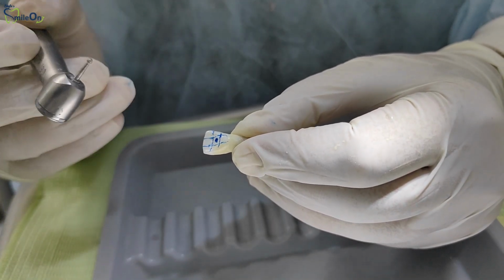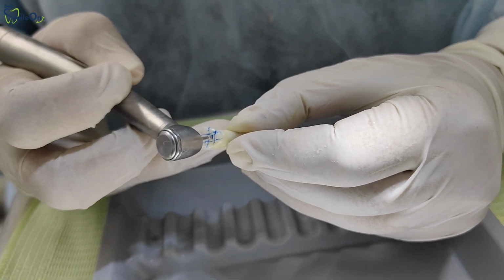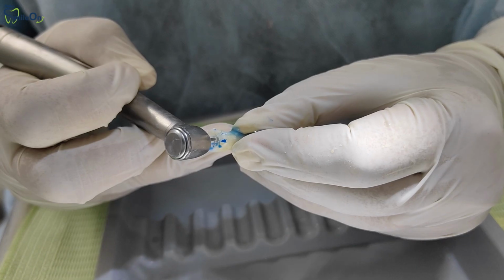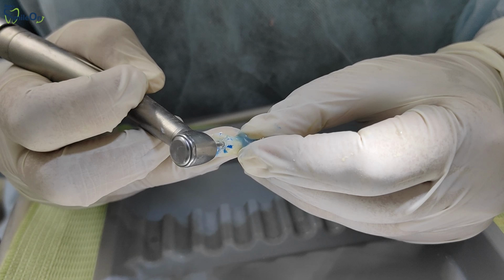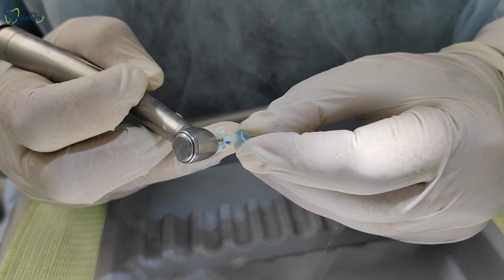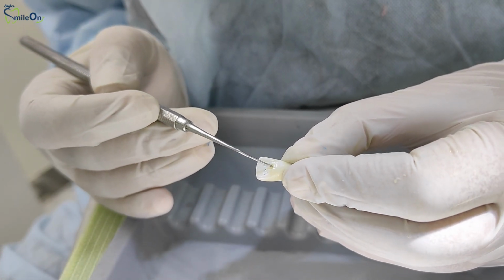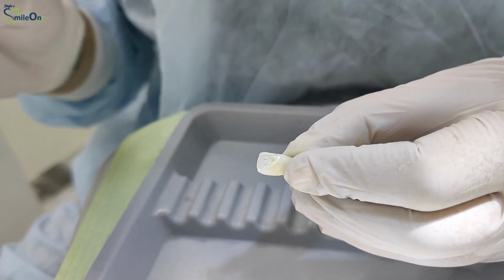I am using BR31. So I am placing this burr perpendicular to the crown. We have to make a ditch and we should penetrate approximately 1 mm into the tooth perpendicularly to the crown. Now as you can see, we have made approximately a 1 mm ditch into the tooth with the round burr.